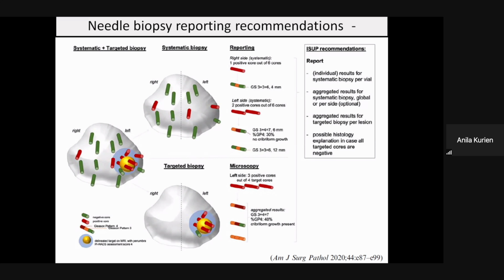So in order to avoid all the confusion, after having done such an elaborate procedure like a transperineal biopsy, you would want the most accurate report. And out of practical experience, it's my suggestion to you that you send an individual core in individual vials.